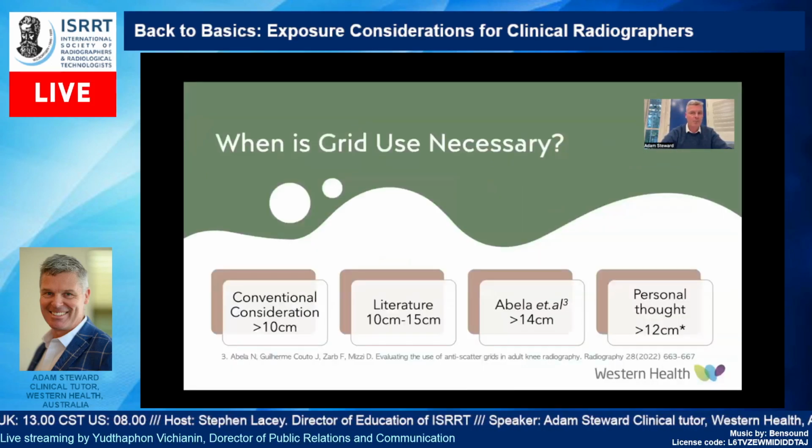All right. Now, they're big numbers, and it's really important. So the really important thing here is, when do I use the grid? And that's a really important consideration.